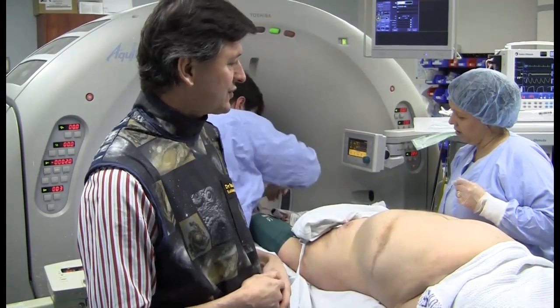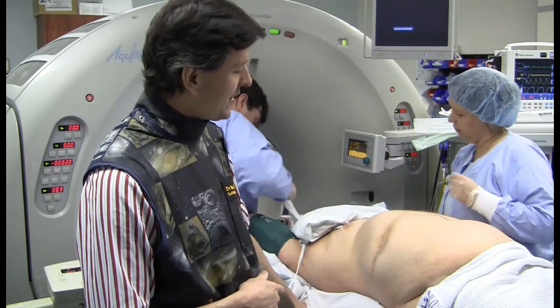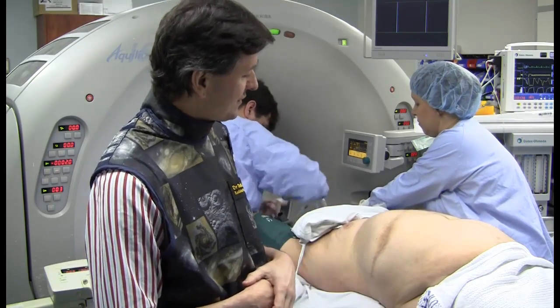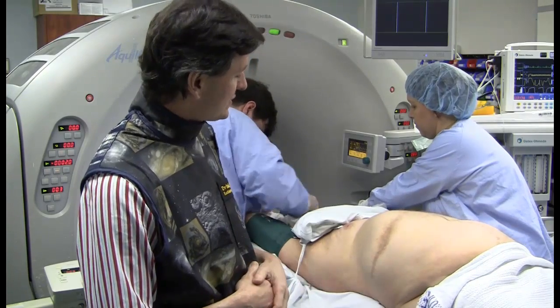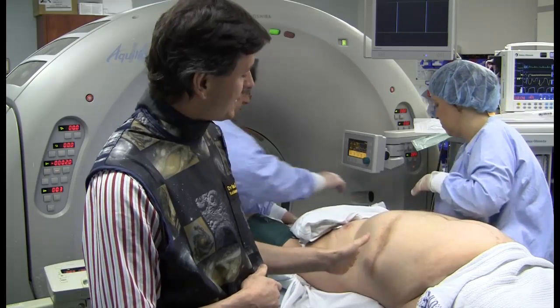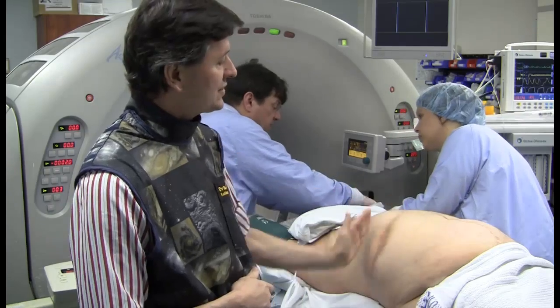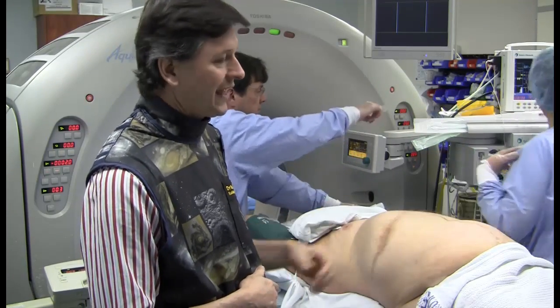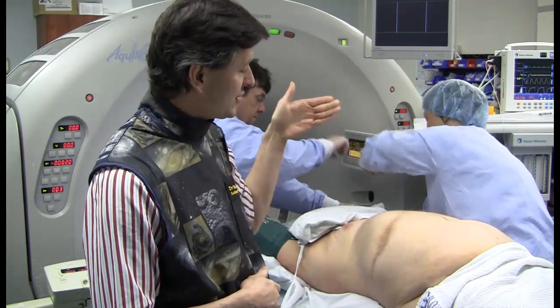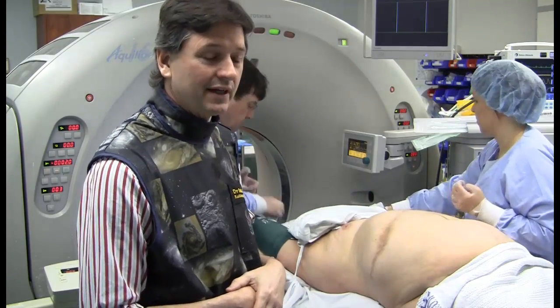We're doing patient positioning here. This is a fairly generously proportioned gentleman. We've put a couple of wedges under the right-hand side because we're aiming for a lesion which is about there. We've raised this right side so that we can get access. Once we've got him in the gantry, we'll show the clearance between the patient's abdominal wall and the gantry, and demonstrate that it's not actually going to be possible to do the traditional perpendicular approach to reach this lesion. So we are going to have to angle in for this patient.